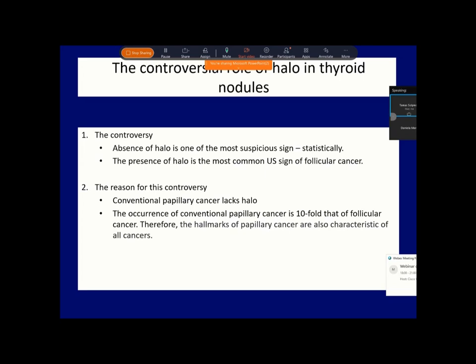The other reason is even more important. As I will demonstrate, follicular cancer behaves just the opposite of papillary cancer. The most common feature of a follicular neoplasia is the halo sign. So if we relied on the absence of halo, most follicular cancers would be overlooked.